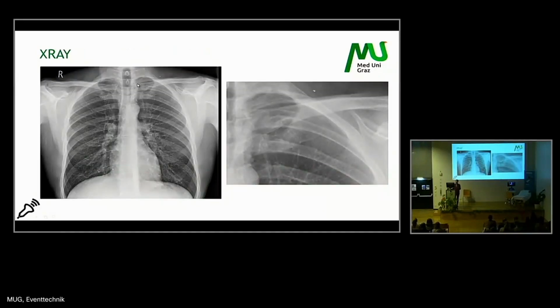And it was a very small pneumothorax on the left side in the upper part of the lung. You can see here is a small line, in this case a little bit bigger. This is the pleural line, and I can show you here with a little marking.